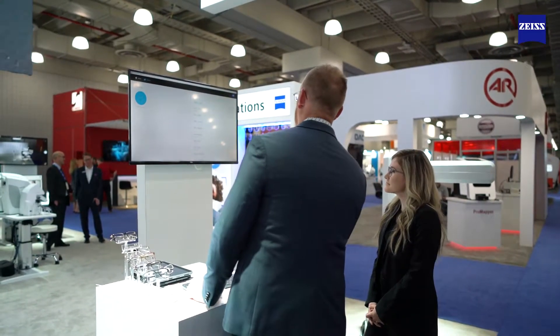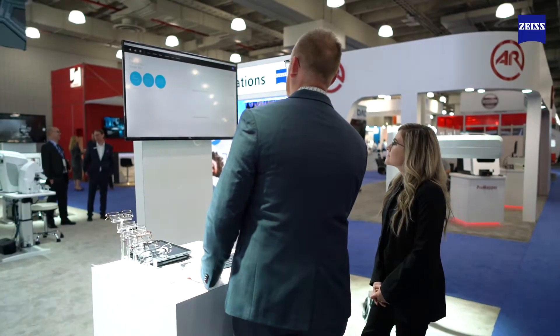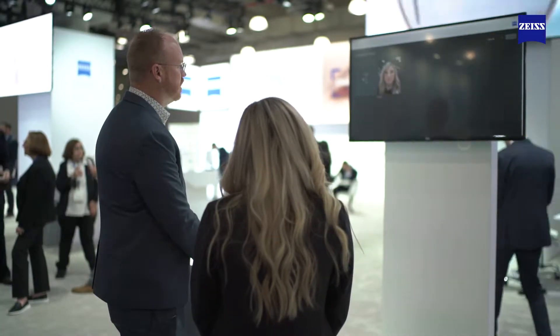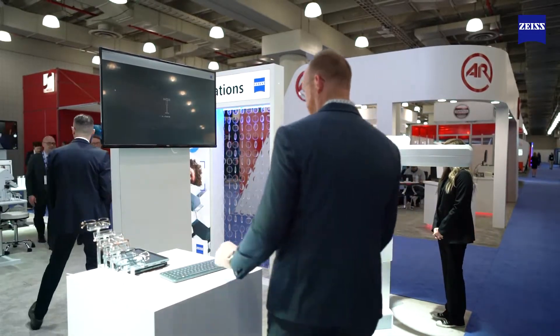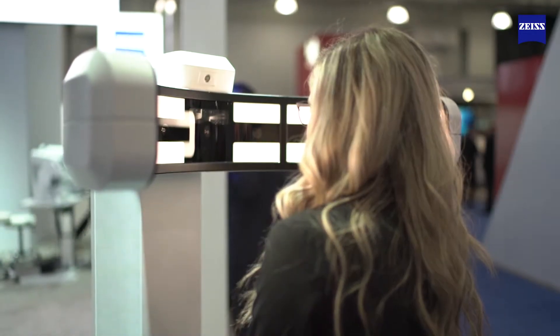So you picked out one frame, so let's go ahead and pull up your consultation here and get that second measurement for your second frame. The first frame you picked out is this one. I'll have you go ahead and stand in front of the device here and look at that red crosshair that's going to show up on the device. Go ahead and look at that red crosshair and hold it right there. Perfect.